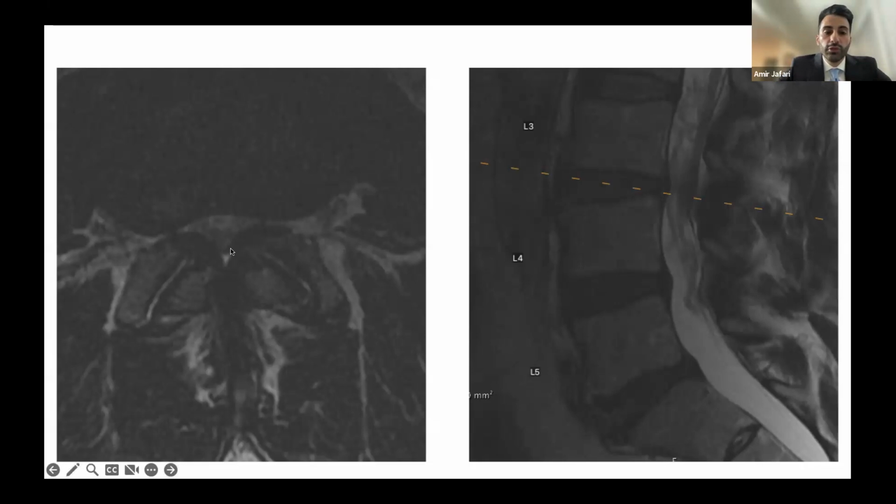So you could see that the lateral recess, the traversing nerves, you barely see them. They're completely compressed. And there's central canal stenosis; you barely see any CSF here. The good thing is there's some epidural fat. When I look at these patients, I want to make sure there's some epidural fat left.